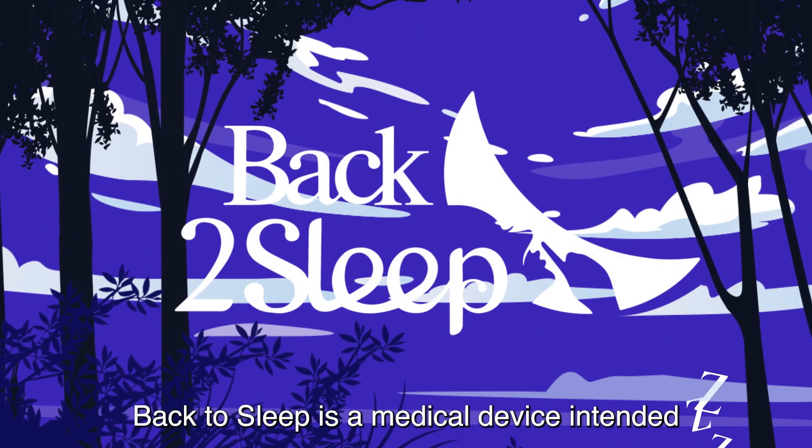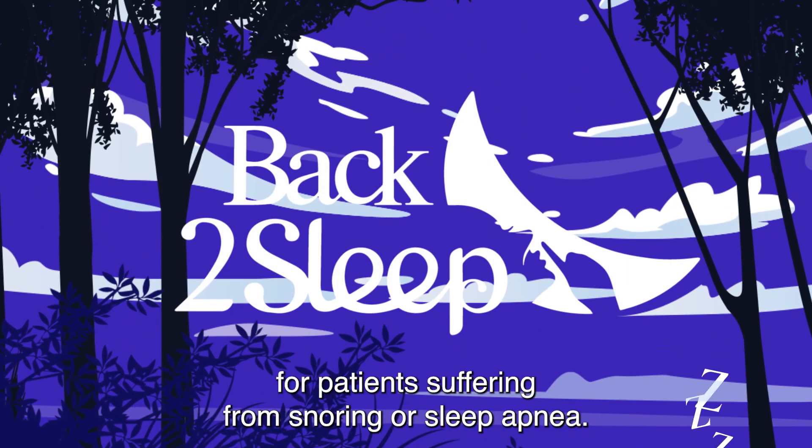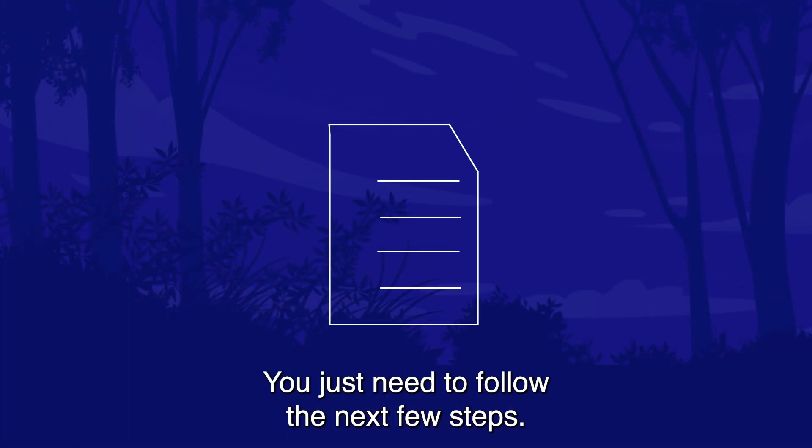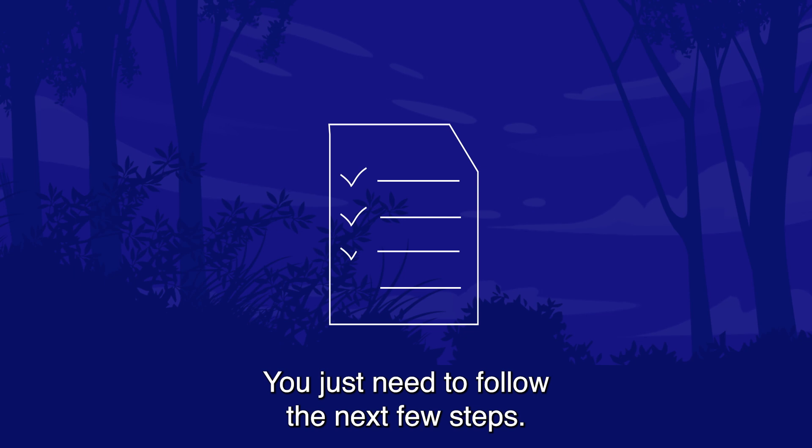Back to Sleep is a medical device intended for patients suffering from snoring or sleep apnea. It's very simple to use — you just need to follow the next few steps.